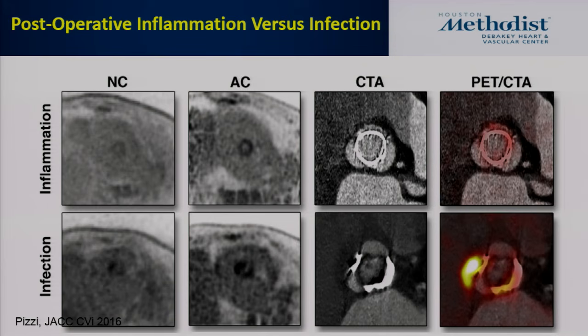But we don't always see a report on CT about the spleen. First of all, we don't usually cover the entire spleen. So if the spleen is in the imaging plane and we see something on it, it's in the report. But if we don't see anything, we don't usually write that there is nothing in the spleen or that the spleen is unremarkable, because with cardiac CT we only report incidental findings that are important. We don't have the standard negatives like for the lung, and if we see something, we report it. Most of the time you get a few cuts on the spleen, not the entire spleen coverage.